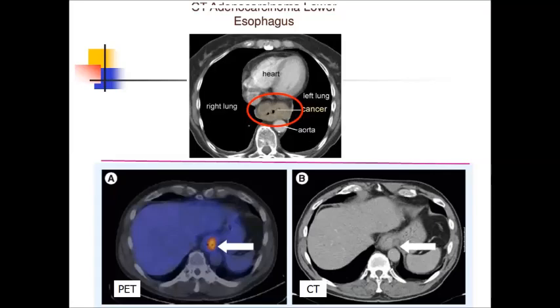If your hospital may allow to provide nuclear medicine techniques, don't forget about positron emission tomography examination, which may show pathologic accumulation of radiopharmaceuticals, and CT combined with positron emission tomography will show you where the pathology is, its localization.